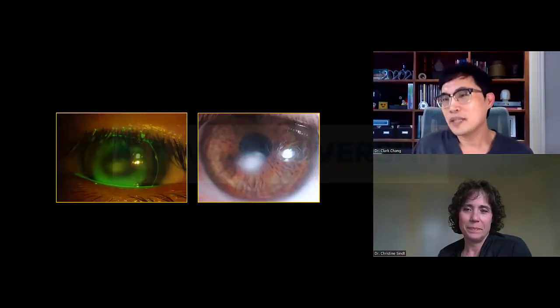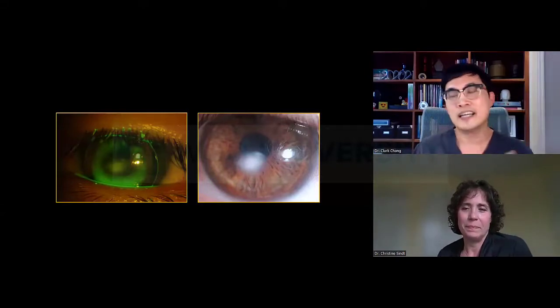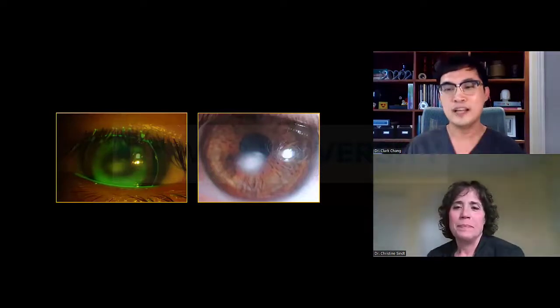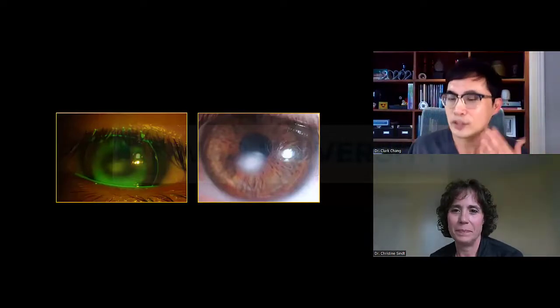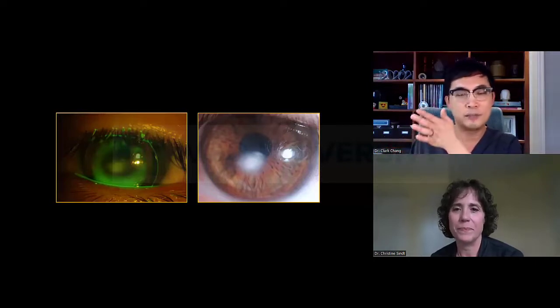I thought it was more lipokeratopathy, probably due to the compression of the corneal GP. And the good news to him is, number one, with those neovascularization, even if he's going to end up with corneal transplant, I would prefer to see if there's something that I could do to get those vessels to reverse course a little bit or dry up a little bit. And I really thought it looks more lipid-like to me rather than the fibroblast type of scarring.